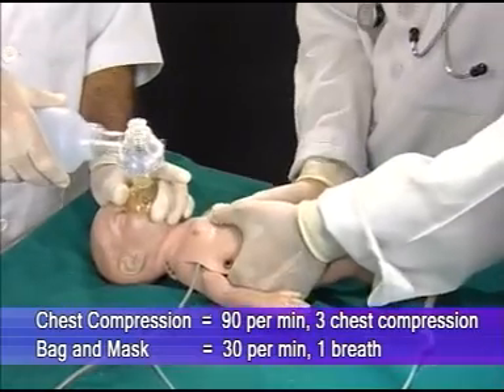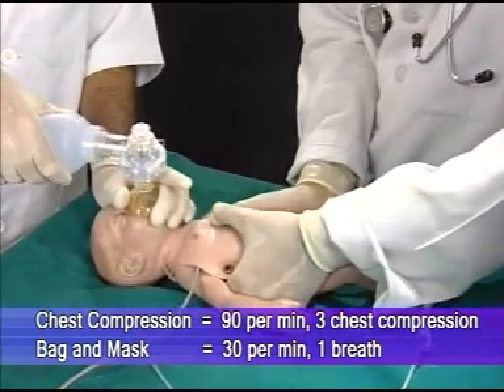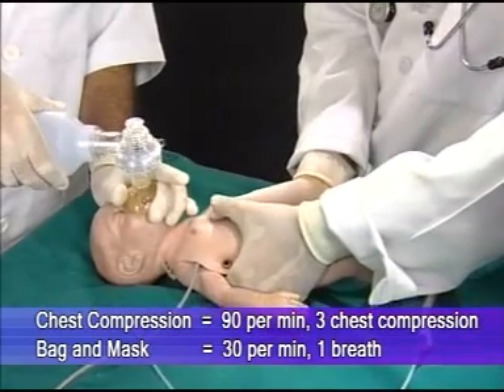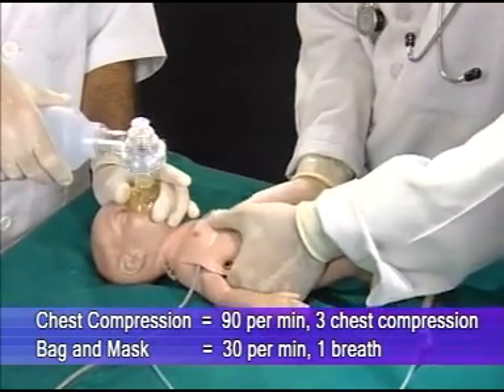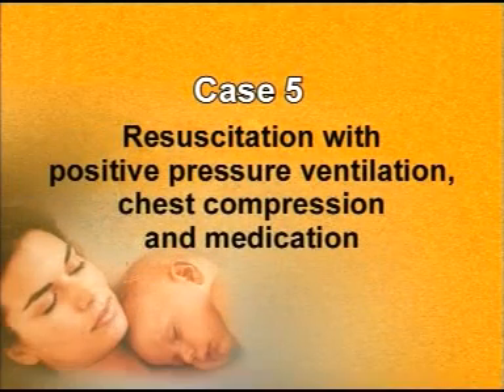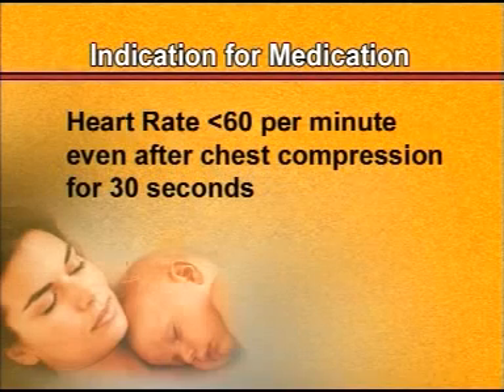The important thing to remember is that chest compression and bag and mask ventilation should be given simultaneously: one and two and three and one and two and three. In case 5 — resuscitation with positive pressure ventilation, chest compression, and medication — if the heart rate is still less than 60 per minute, all interventions continue and medication is also started.